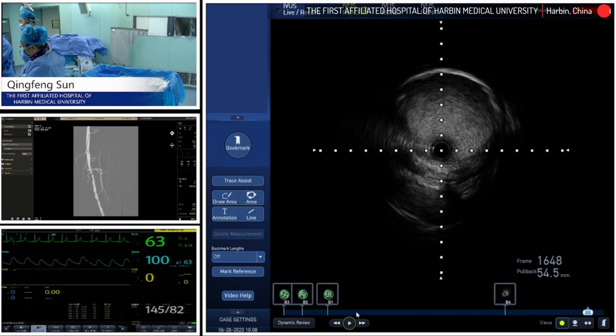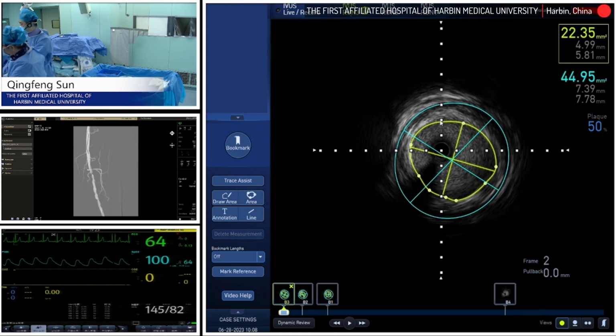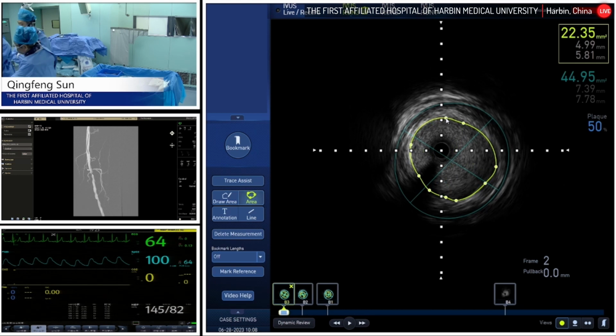Okay. Of course, in the severe stenosis lesion, they are lipid plaque? Lipid rich. Okay, some lipid plaque composed with fibrosis. So are we good for the progressive PTA, Dr. Song? Yeah. Okay.